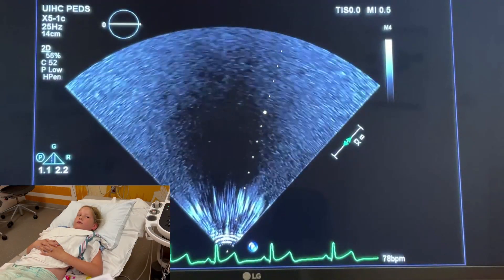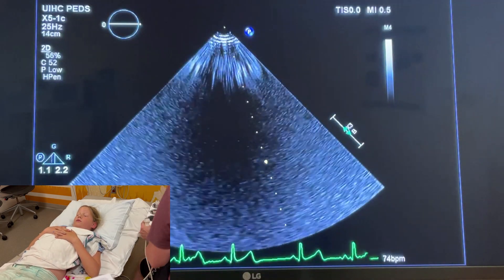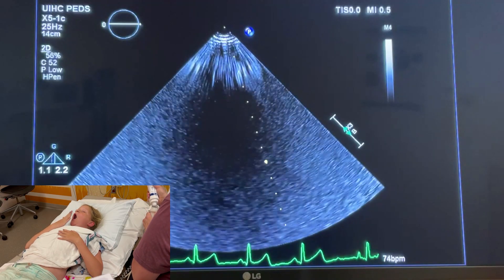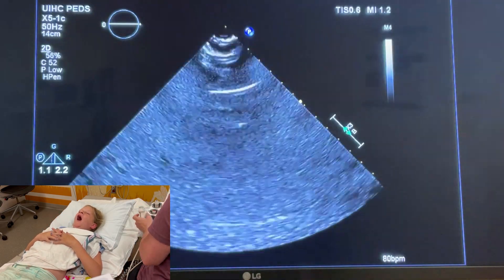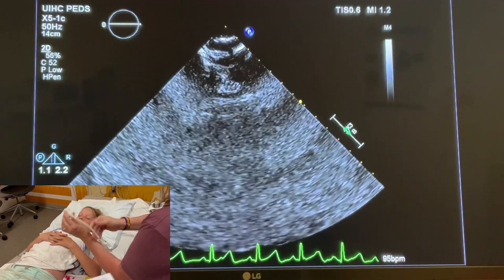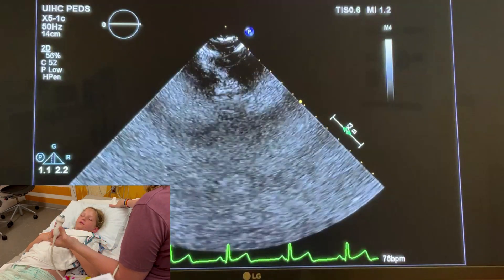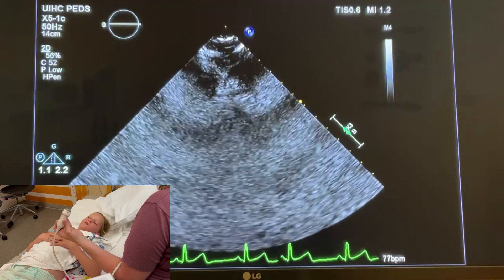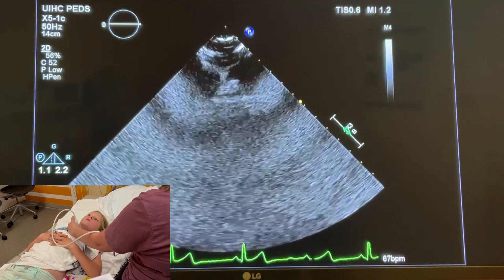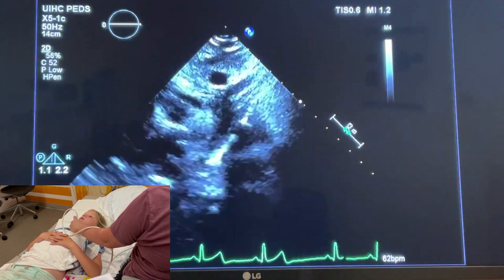Now we're going to work on the suprasternal notch. You need to change the orientation of your sector to the point being to the top and down, so you have to flip it up-down. The notch is going to be at the top facing up towards the ceiling, and oftentimes you'll have to remove the pillow and have the patient tip their chin towards the ceiling so you can get into that notch. You're going to go right here in the middle and tip down towards the feet.